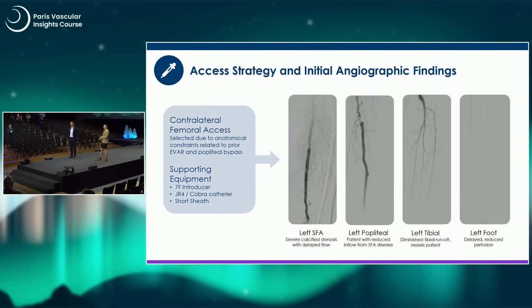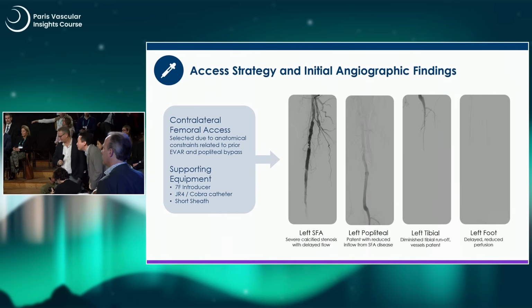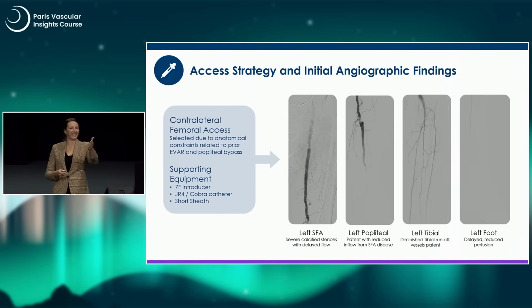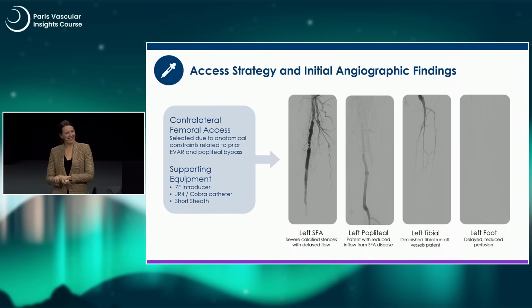In my country, we have several types of atherectomy devices. In this case, I prefer the no-stent strategy with atherectomy, and the coated balloon is better than the stent, I think. So that's going to be my talk afterwards. I'm just going to finish Celine's talk, and then we'll see my point of view, because I kind of agree with you. Good. You may work in South Korea.